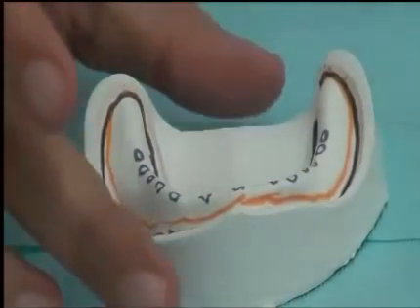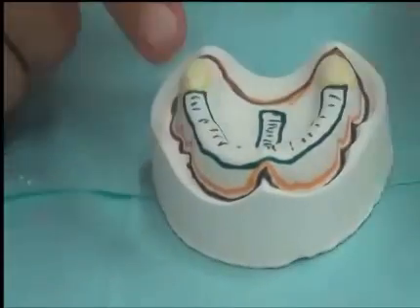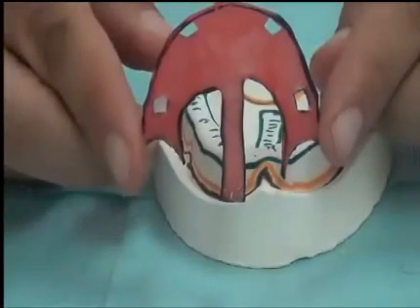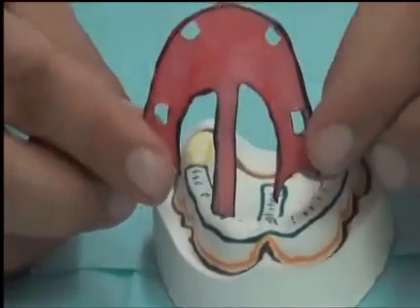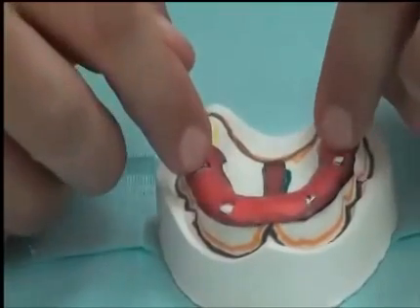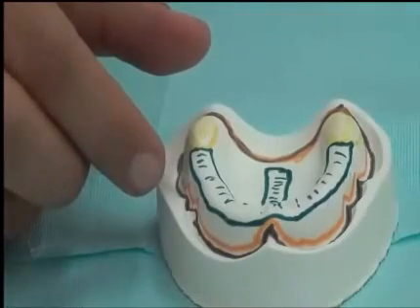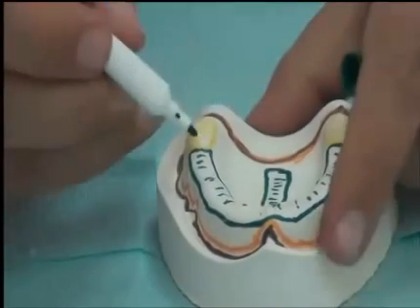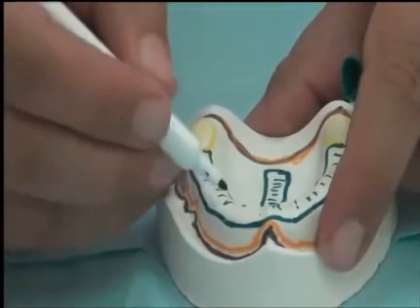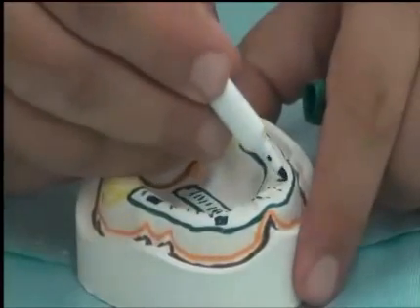To maintain that the support area is not reduced while taking impressions of the wax relief, we place what we call stoppers. These are openings from which the acrylic will come in and touch the tissue inside the patient's mouth, so the impression is not squeezed more than required into the patient's mouth. So in the wax, we're going to place stoppers. 2 in the posterior area and 2 in the canine area. So these are stoppers.